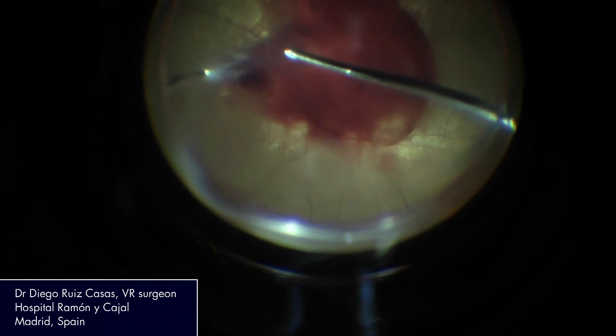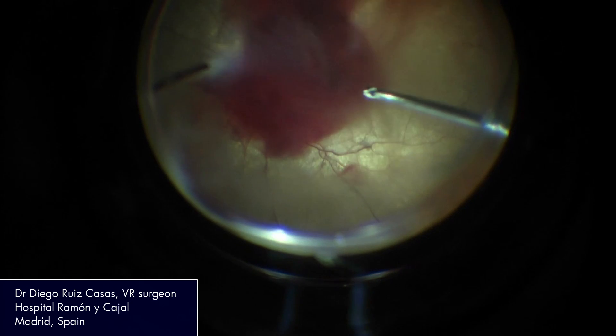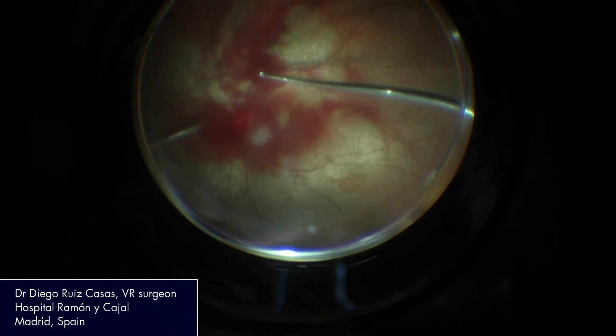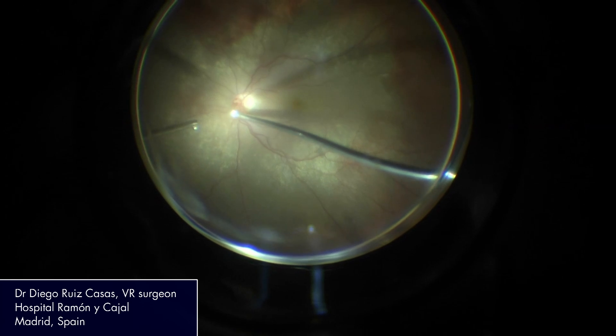You can set the perfect parameters in each step of surgery and also in each case. The BTI pump is of paramount importance in the IVA platform — it combines the best of two worlds.